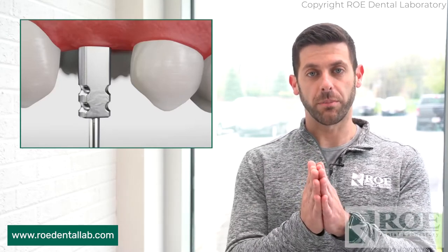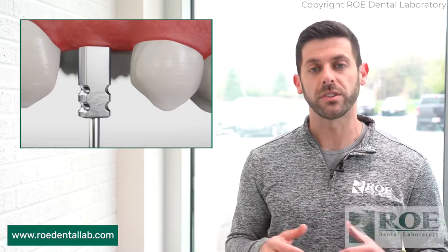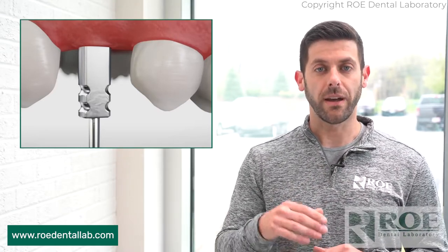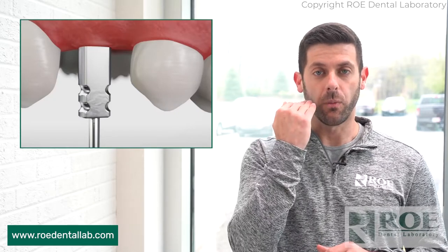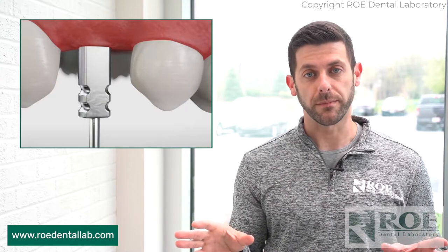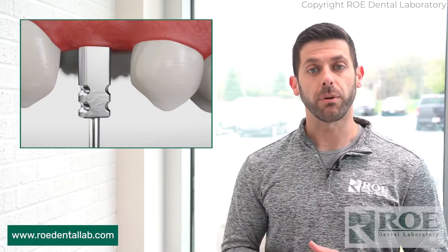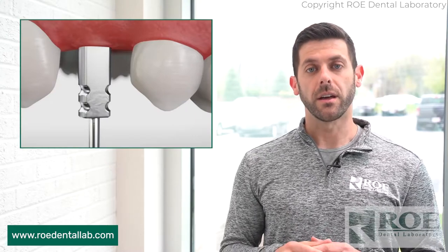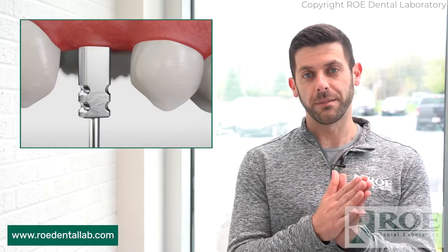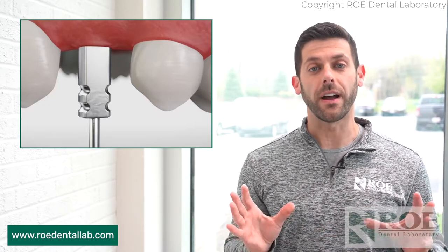Please make sure with our closed tray impression there is no hole, because a lot of the closed tray impression posts are designed to have a vertical stop with the impression tray itself. If there's a hole, it's going to mess up the entire impression. So once you remove the healing abutment, seat the closed tray impression post. If you're not sure if it's seated, please take an x-ray. We always recommend taking an x-ray no matter what to verify that it's seated.